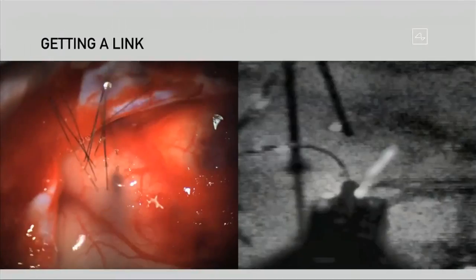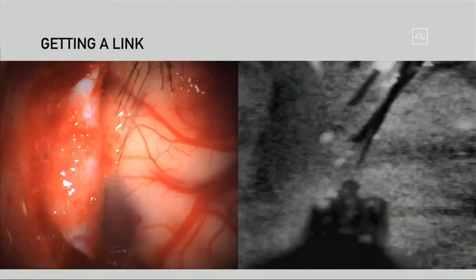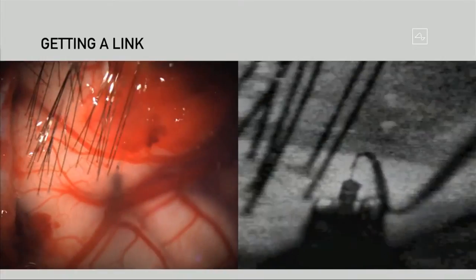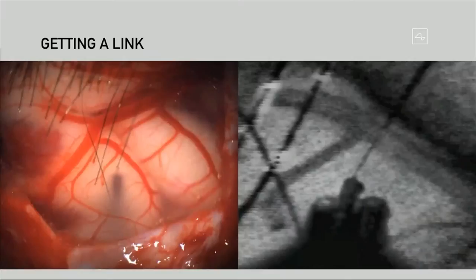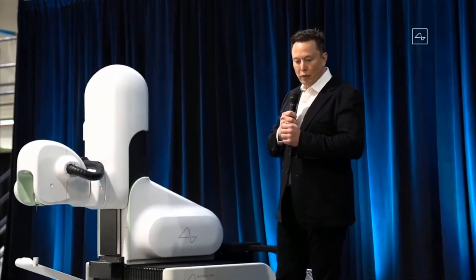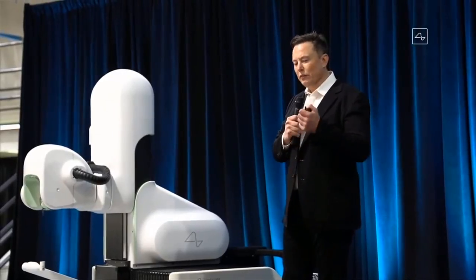This shows you a close-up view, which I think is not too gruesome, of the electrodes being inserted in the brain. If you look closely, it's a little counterintuitive, but if the electrodes are tiny and inserted very carefully, there's no bleeding. The robot actually images the brain and makes sure to avoid any veins or arteries, so the electrodes can be inserted with no noticeable neural damage. You'd think if you stab something with a wire, surely it will bleed, but at a really small scale, it does not.